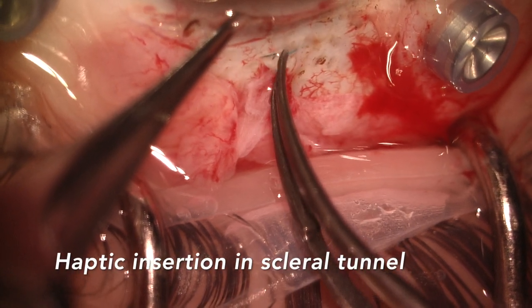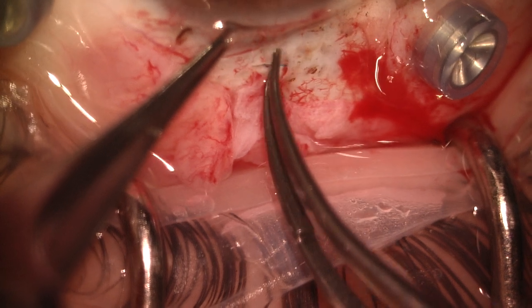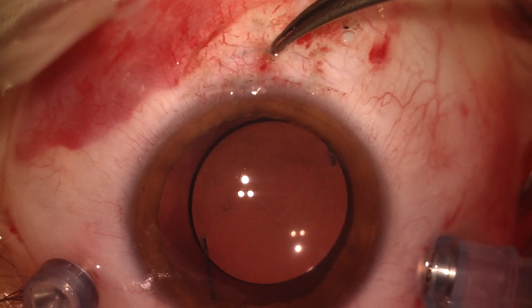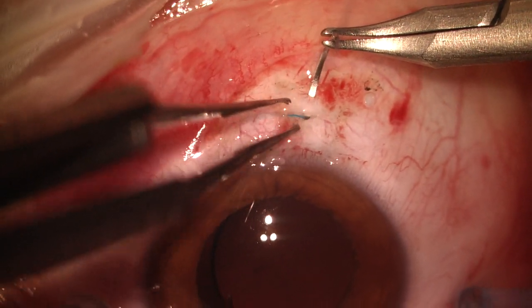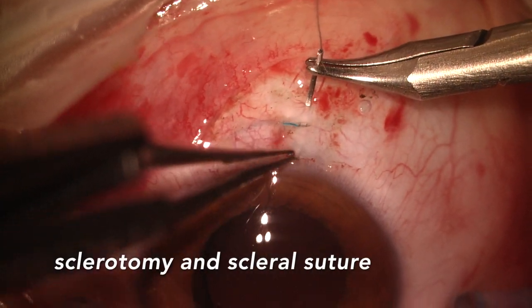Both haptics are positioned in the tunnels and we make sure the implant is correctly centered. The sclerotomies and the conjunctiva membrane are finely sutured using Vicryl 10-0.